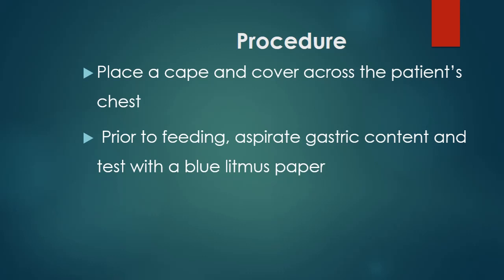Flushing with water is even very dangerous, because should it happen that the tube is not within the gastrointestinal tract but rather within the respiratory tract, the water that you have flushed inside, how are you going to bring it back? So please, the best way to do this is to use imaging, if it is available. But if it is not available, use the litmus paper. But do not resort to flushing with water, placing the end of the tube in a bowl of water, and other crude ways.